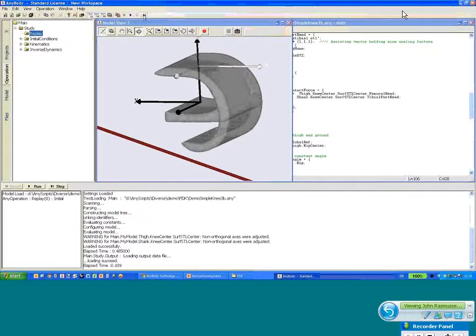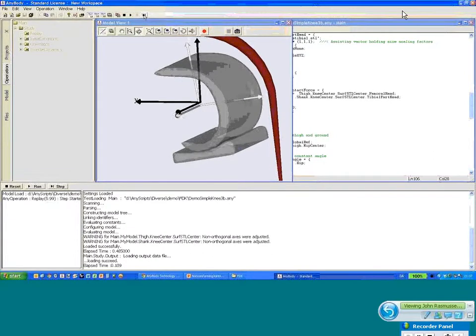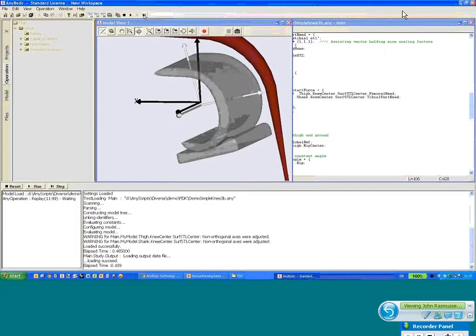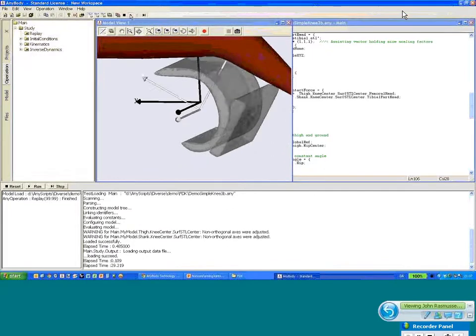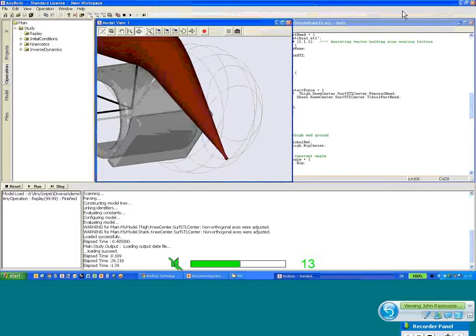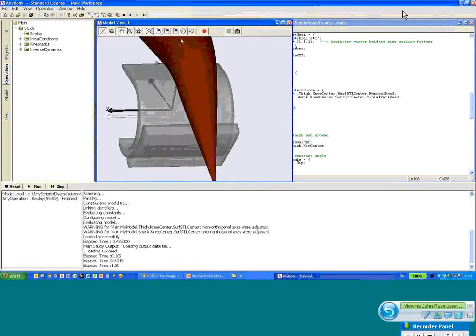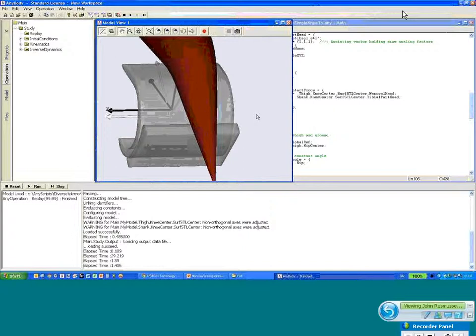So if we go here, we can try to single step through this. You see, if I make one step, the two parts will now come into contact with each other. And remember that the bones are also here. We have the femur and the tibia in the model, but I've just graphically switched them off so that we can see what is taking place. Then if we step here, you can see that now the two are beginning to move with respect to each other, depending on the contact forces between them. And if we just click play here, you will see we will get the whole analysis going on. And we can look at that from different sides, maybe a little bit more from over here, so you can get another vantage point. And you can see here how the two surfaces are sliding on each other while the contact is being calculated.